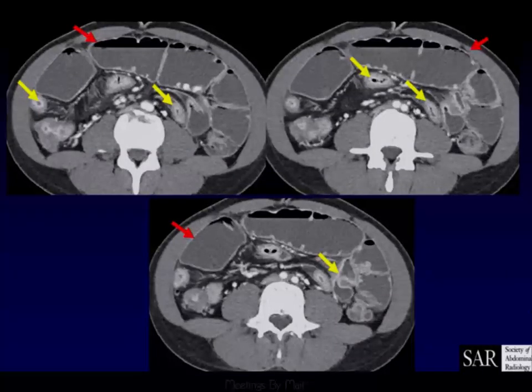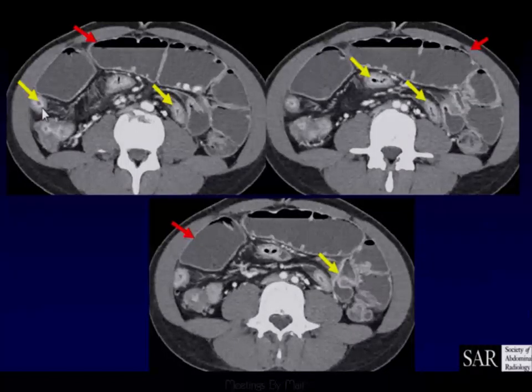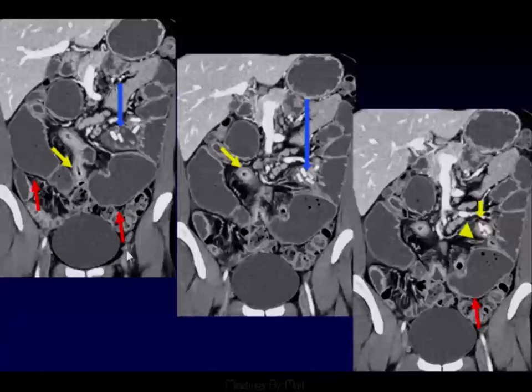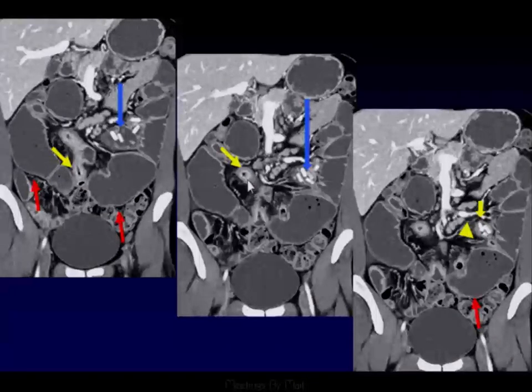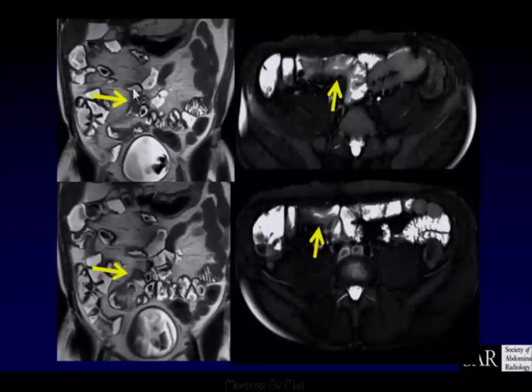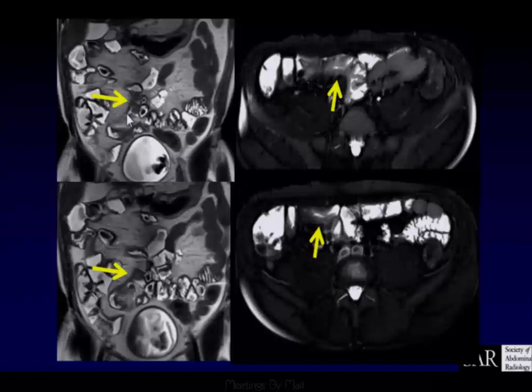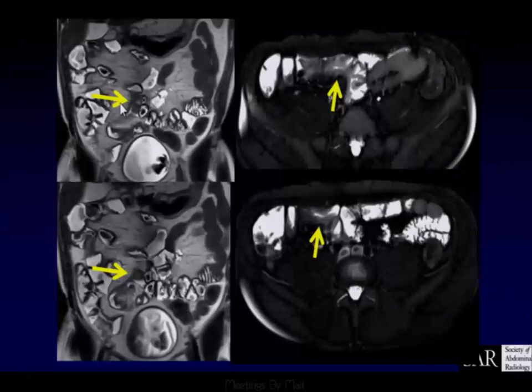Here's probably the most egregious example I have. We have multiple sites of luminal narrowing and a stratified hyperenhancement pattern, but all these dilated loops are not colon but small bowel. In the coronal view, a lot of active disease — notice the asymmetry. We've got some pileup of enteroliths upstream to these strictures, but these are strictures with active inflammation because you see stratified hyperenhancement. There is no other disease in the world that looks like this — this is Crohn's disease, easy to see.